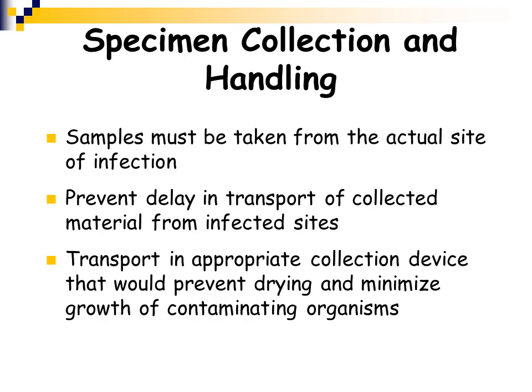In the ideal world, there would be no delay, and samples would be tested immediately after collection, but that's not really realistic. If the specimen is transported, it needs to be transported in an appropriate collection device that will prevent the organism from drying out or possibly being overgrown by contaminating organisms. So there are special transport media that are used for patient specimens.